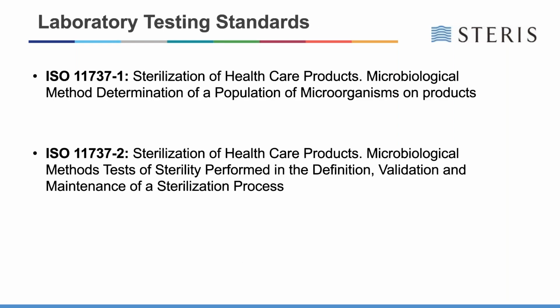The next important aspect to remember here is the standards involved with these laboratory tests. The first one there is for bioburden, the ISO 11737 Part 1. The next one is the sterility tests and the bacteriostasis/fungistasis testing. This is in the ISO 11737 Part 2.